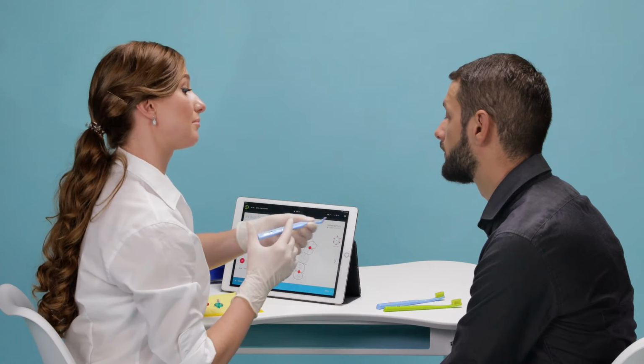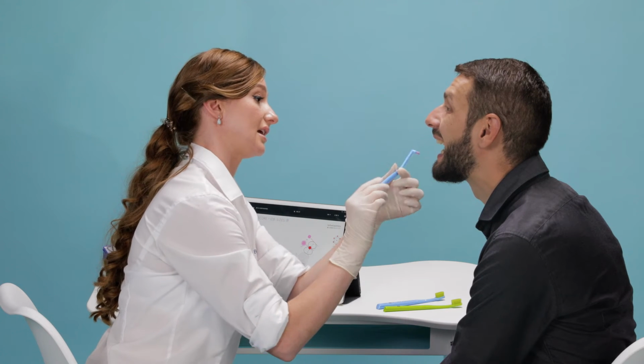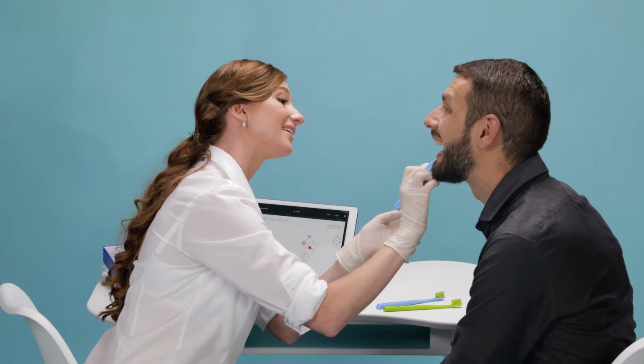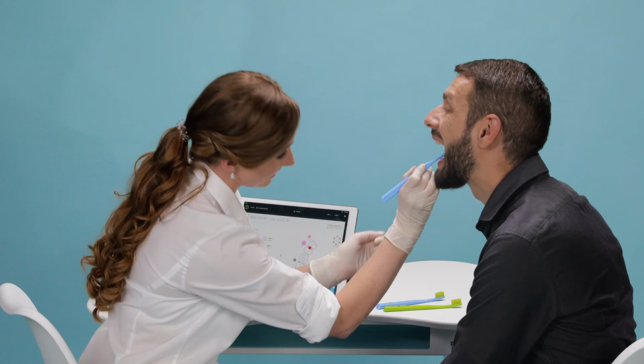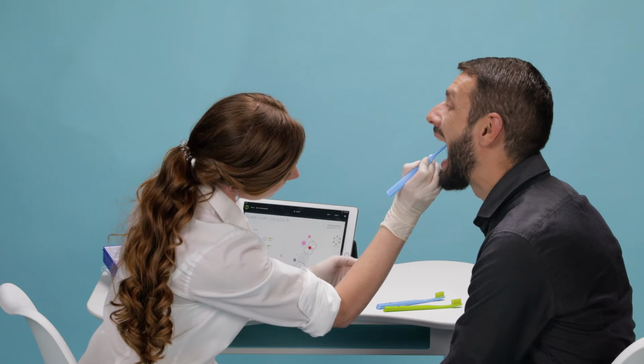I also use a single tufted brush in this sextant, as Edward has a large interdental space here. I input this brush into the Bob score, which appears then as a grey circle on the chart.